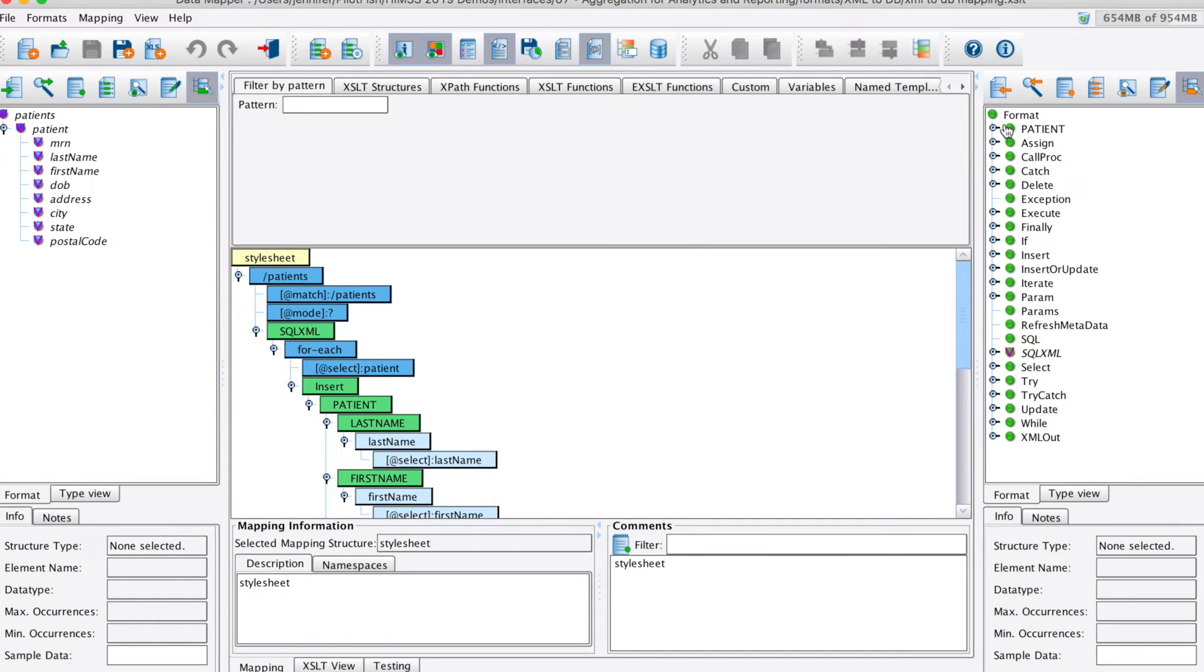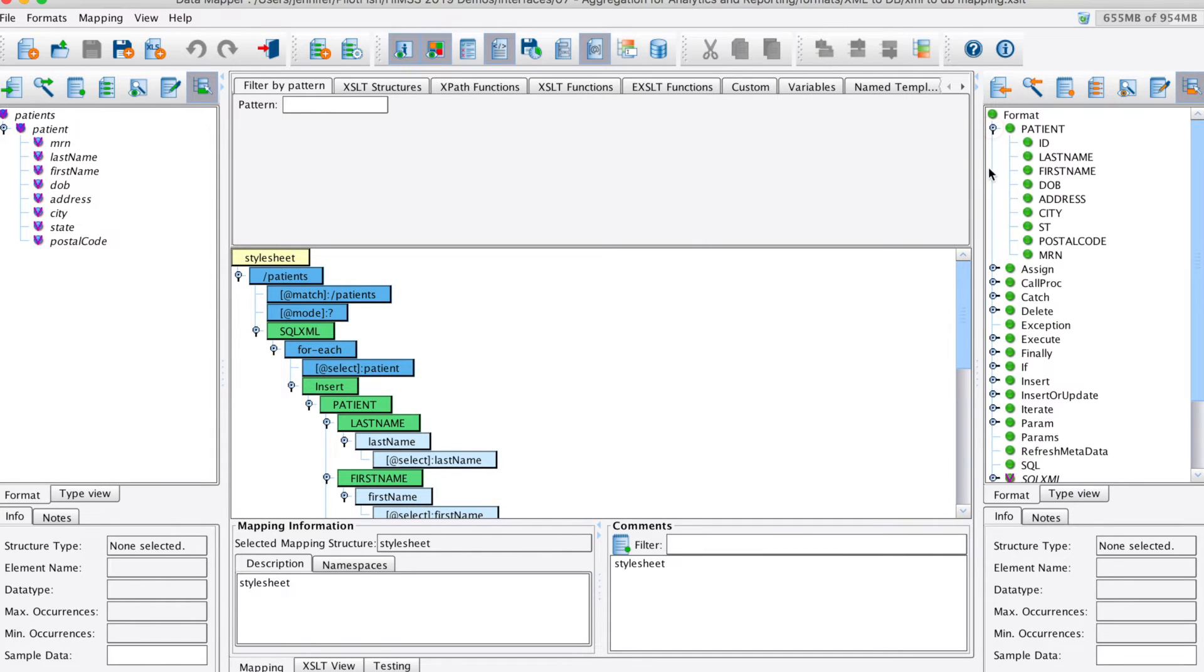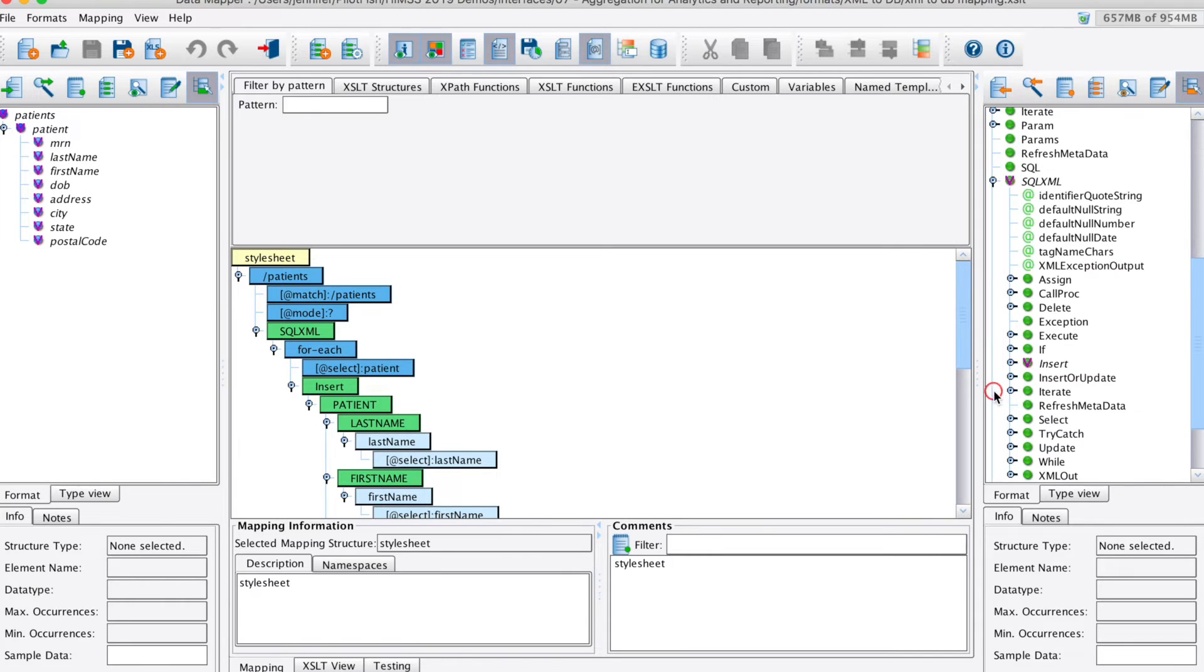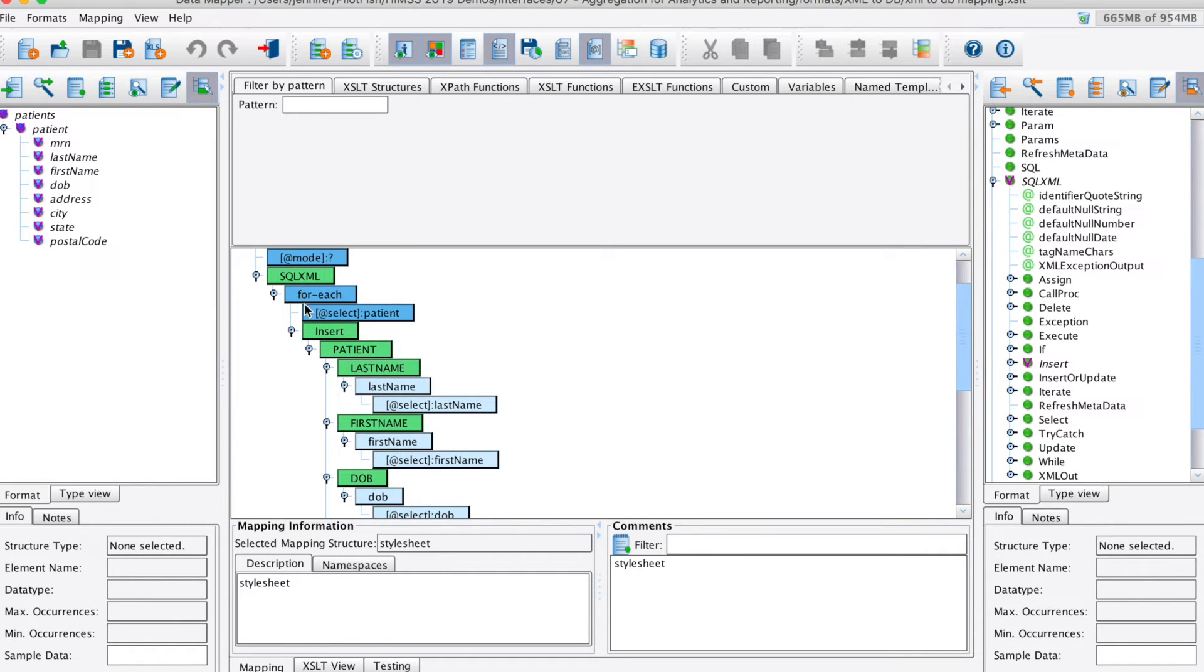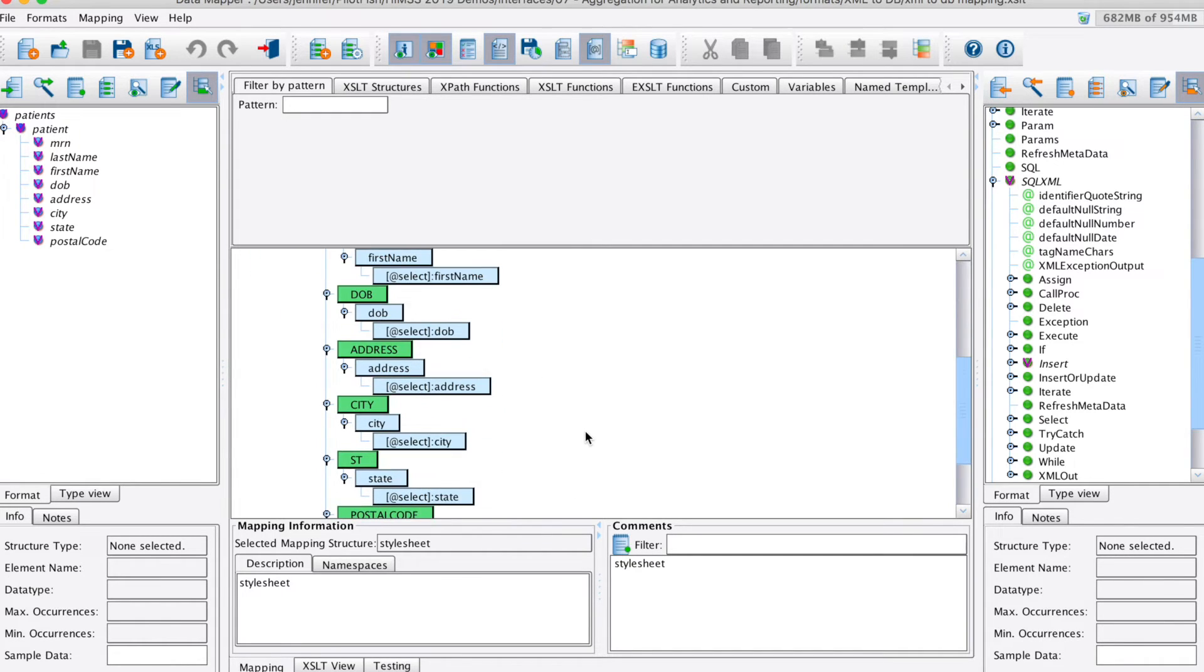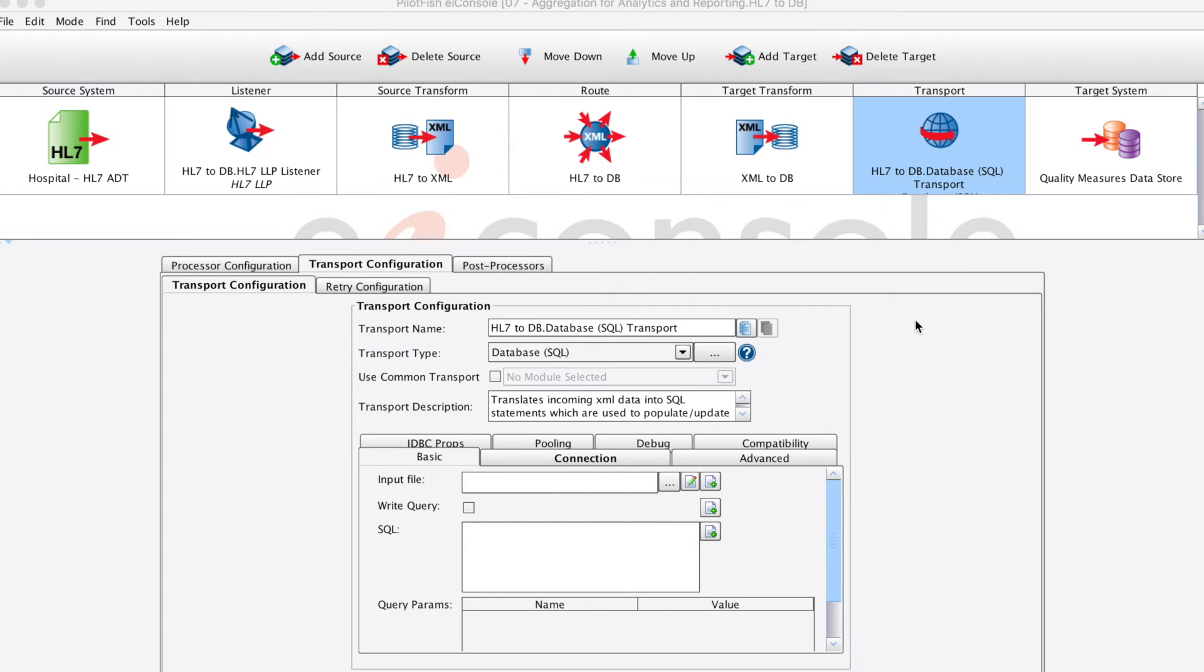On the right hand side, we've connected up to a database and loaded in our tables and also have statements and functions below. Our mapping here in the middle indicates that we will insert this information from our source system into these rows and tables. Once this is complete, we can go to our next stage.